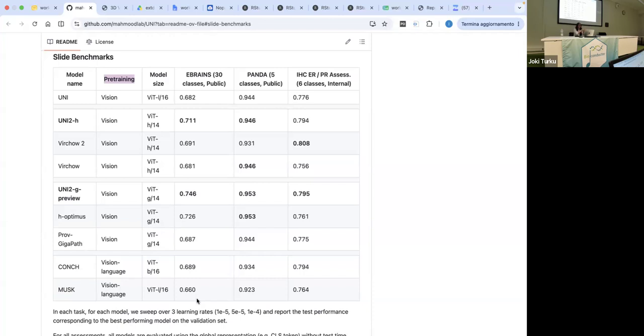And right now, with these embeddings, of course, you can also perform a classification, but the architecture of the model is more complicated. And maybe sometimes using something simple like a convolutional network could be not the best, but maybe I want to give these models a chance just to see if they perform well.